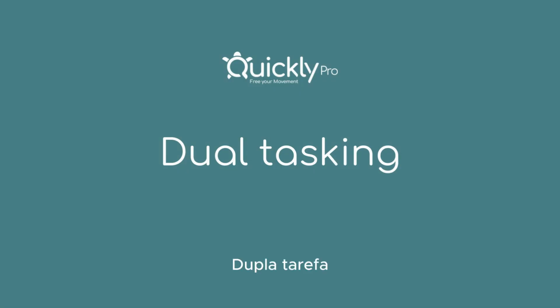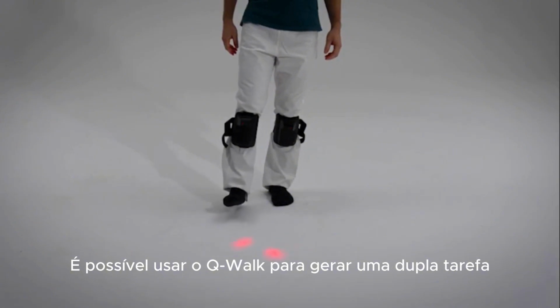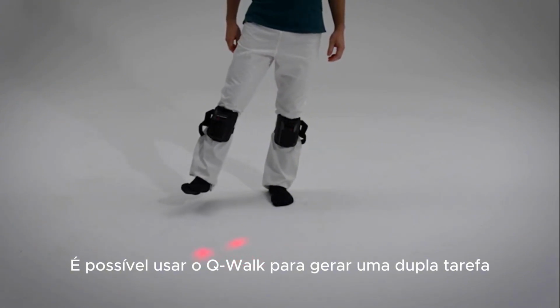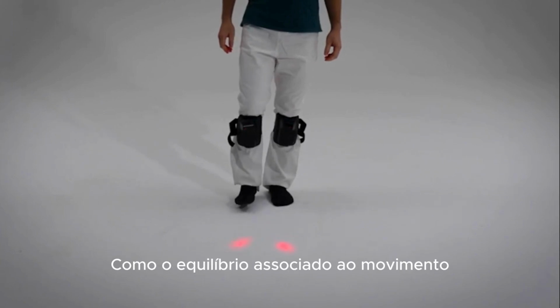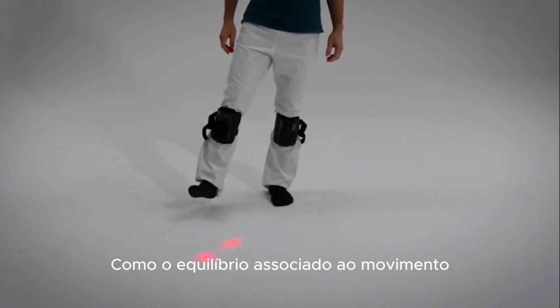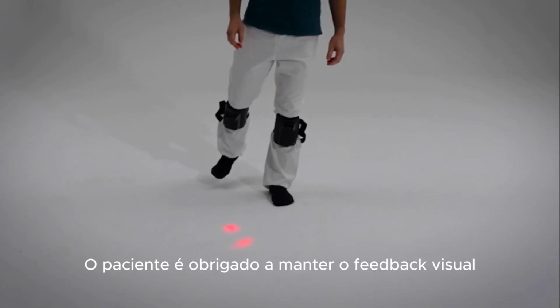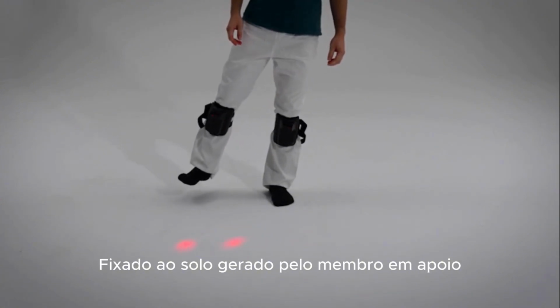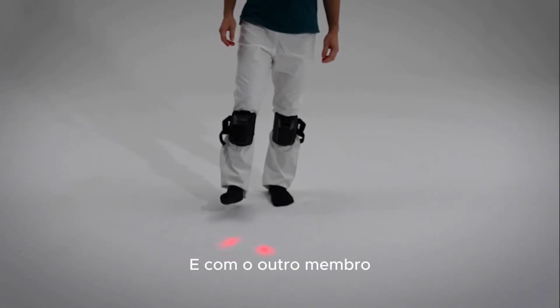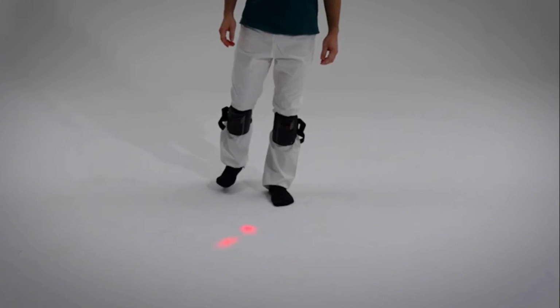Dual tasking. It is possible to use Q-walk to generate a double task required of the patient in order to work on programming and motor control, such as balance associated with movement. In this case, the patient is required to keep the visual feedback fixed to the ground, generated by the limb in support, and with the other limb perform circumduction movements.